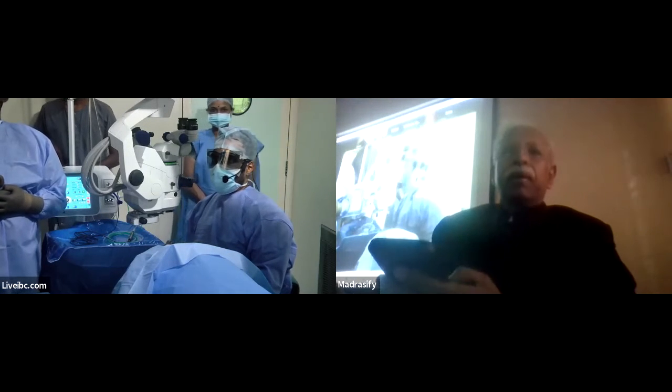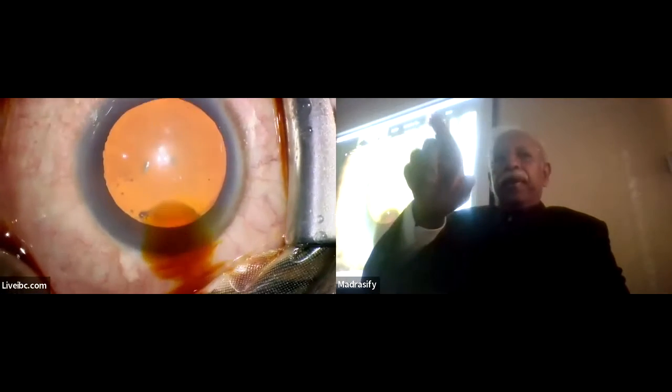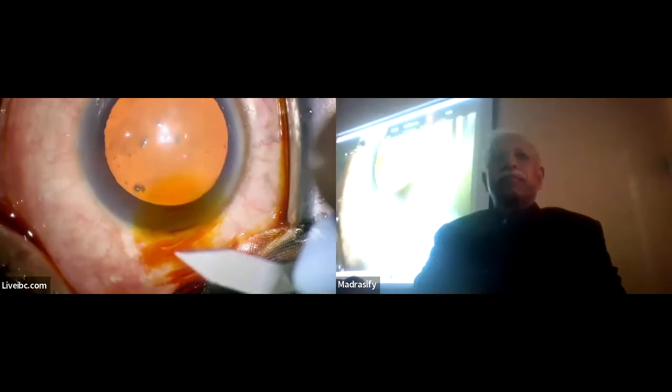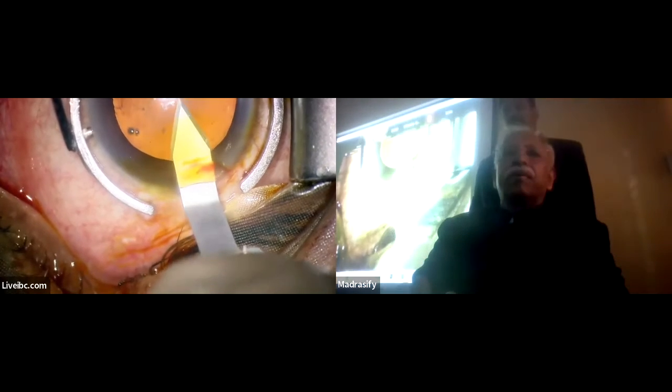I'm starting by making my incision mark again. This is an instrument we have developed to give a proper marking to make the correct incision. It makes two marks, as you see. Make a groove here with your keratome. You can see the mark, second mark there. So you enter with the first mark, reach the second mark, then tip down, pierce and enter the AC. We have a beautiful tunnel.